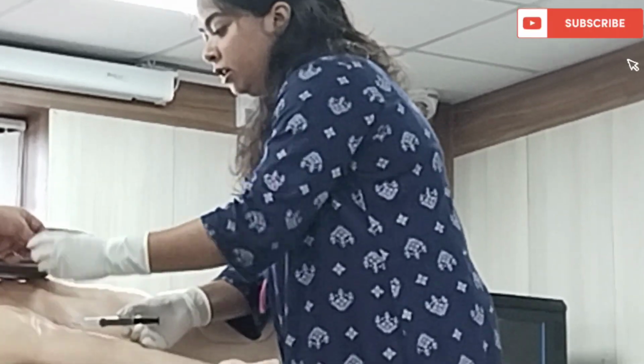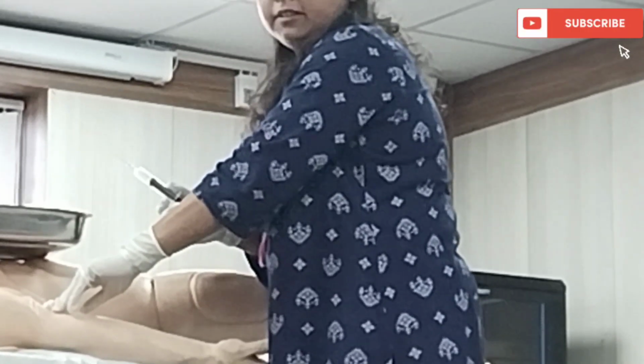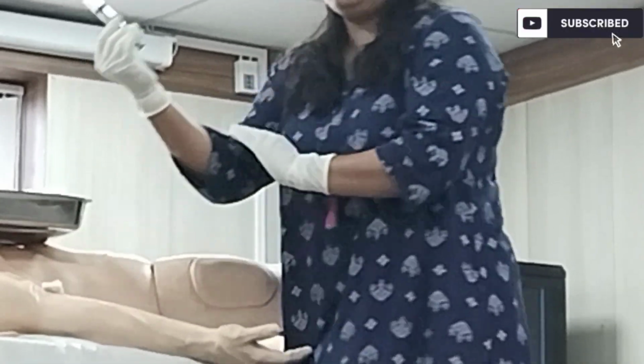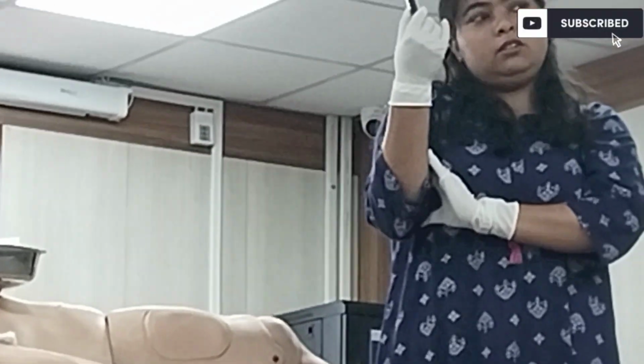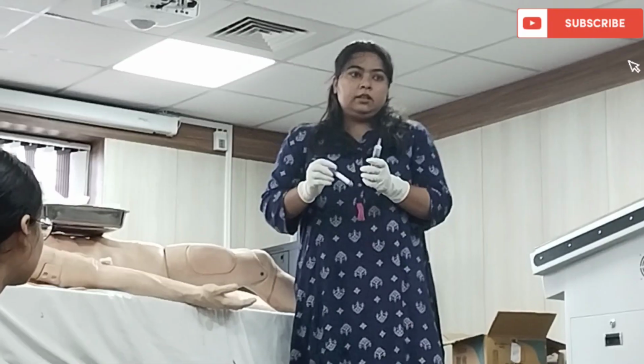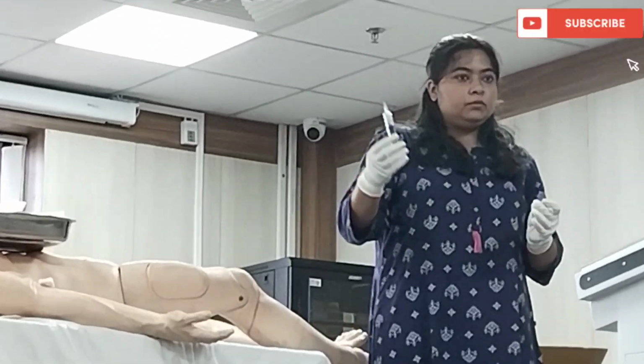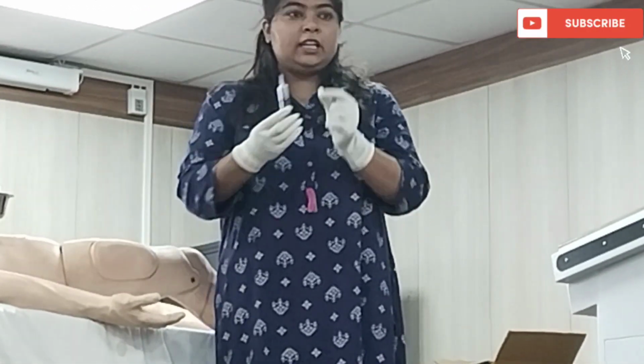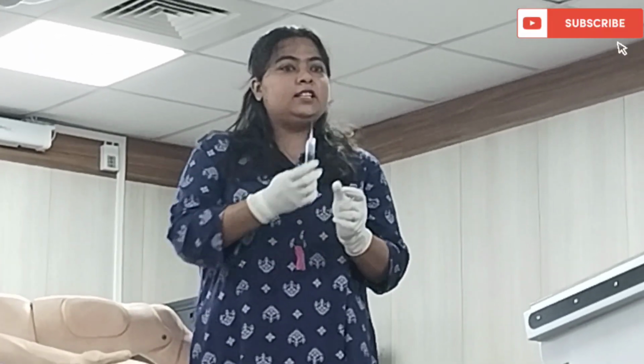After that, take the cotton and put it on the patient's hand. If the patient is able, we will ask the patient to hold the cotton in one hand and flex it for 1 to 2 minutes. Sometimes in other laboratories you will see that when you are drawing the blood, they will attach the container with the syringe, and while you are drawing the blood, the container will get filled.